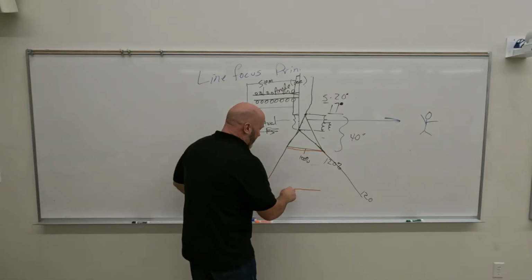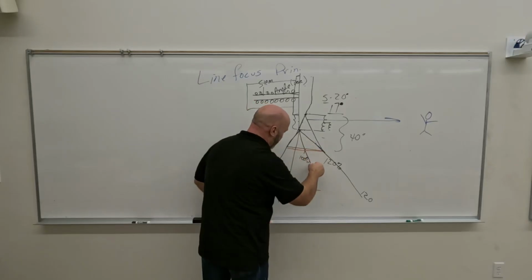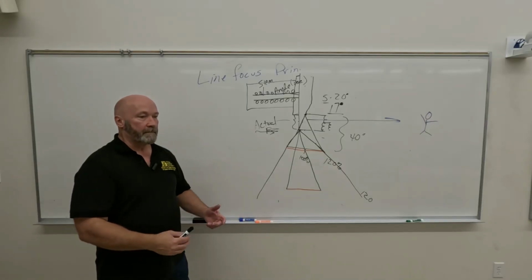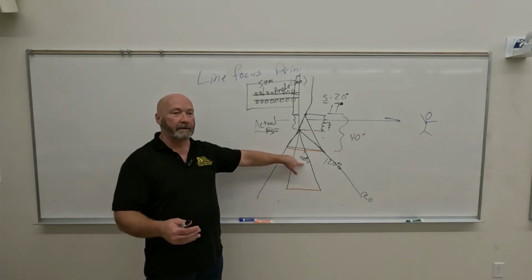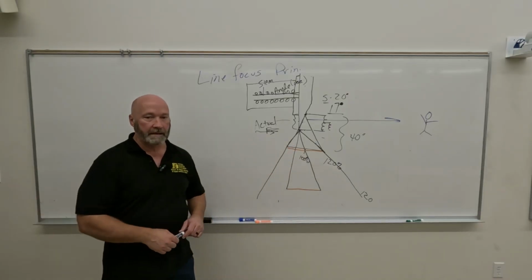Right. So now my X-ray beam, we're going to collimate down to that. Okay. Much closer to what we want. Much closer, by that you mean to the 100%? 100%, yeah. Right. So is the anode heel effect as significant at low SIDs as it is at large SIDs?